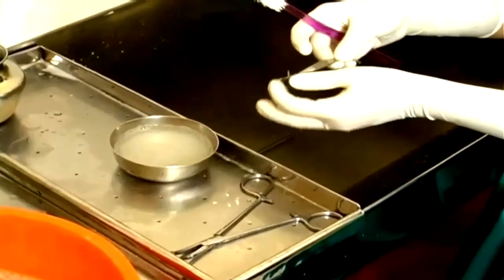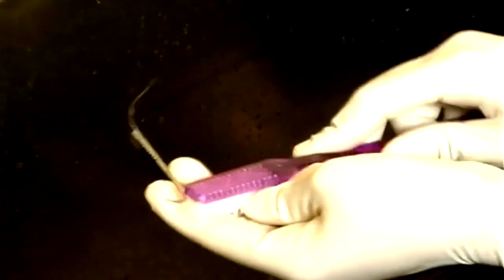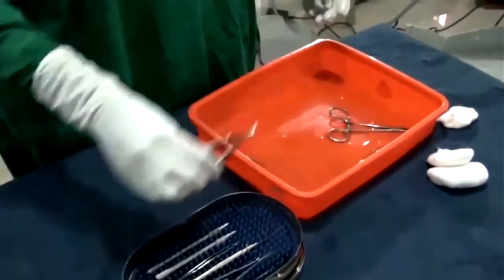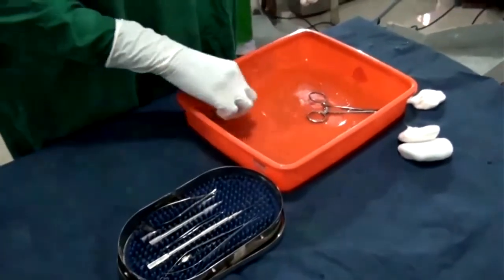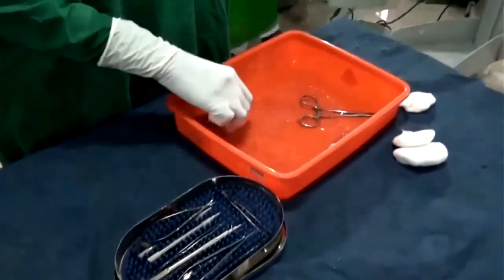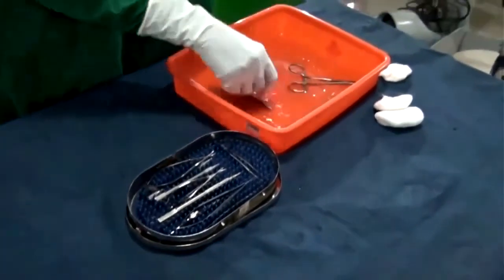What I was saying about aerosol is this: when you do it outside, you can see the aerosol flying out, it's all contaminated. It's better to clean it within the solution and never pack them wet. Any packed wet instrument, autoclave will not work. It should be dry before you pack them. This is being packed without drying.